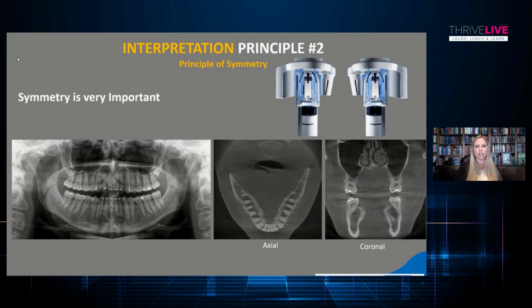And that's what we teach any of our new residents coming in as well, is that you're going to want to use symmetry in the very beginning. It is definitely your friend. And then, of course, all of the anatomy you will pick up as you're going through. You'll start to remember it all from your dental school days.